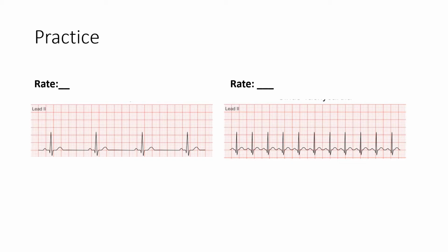Here's a practice. Pause here and calculate the rate using whatever method you want.